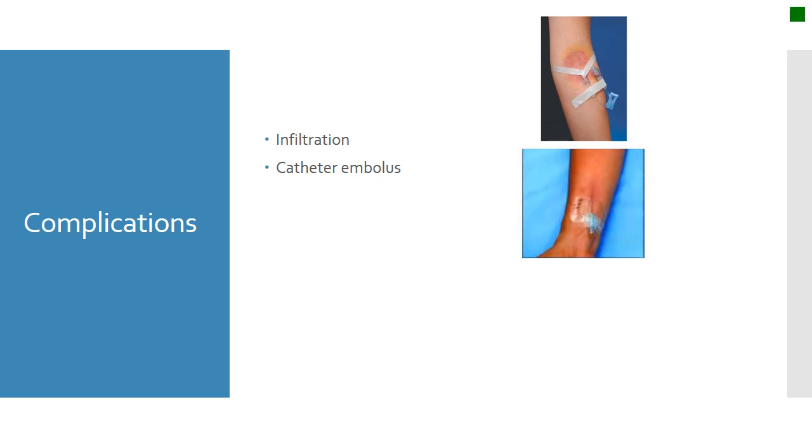There may be other kinds of embolus, so clots that may form in the IV itself, the catheter. This can happen if you're not flushing your IV to ensure patency as you're supposed to on a frequent basis. So blood backs up into the catheter tip and stays there, and blood that stays clots.